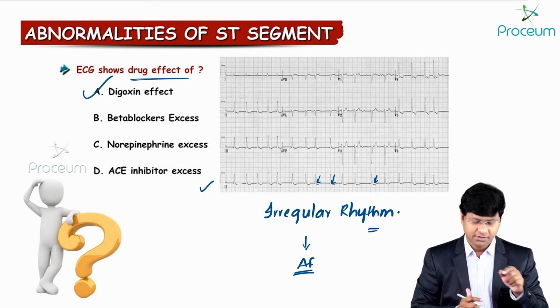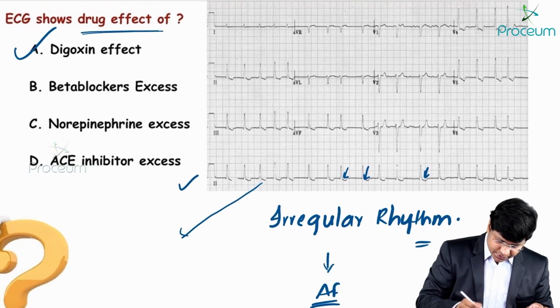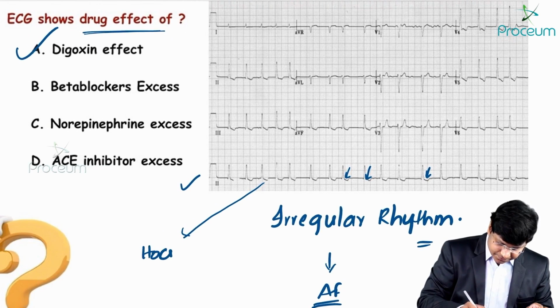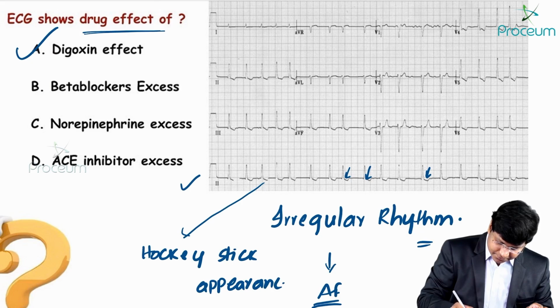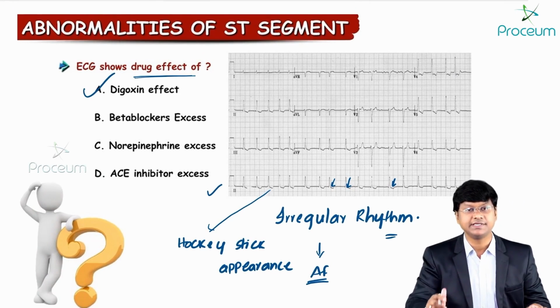We have another terminology: if you see this, it is also called the hockey stick appearance in the ECG. So that is nothing but your digoxin effect.